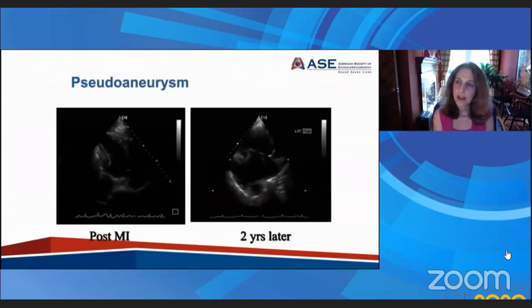So this is just a breakdown of some of the complications that we can see in patients who present particularly late with a myocardial infarction and how echocardiography can help us identify the cause.